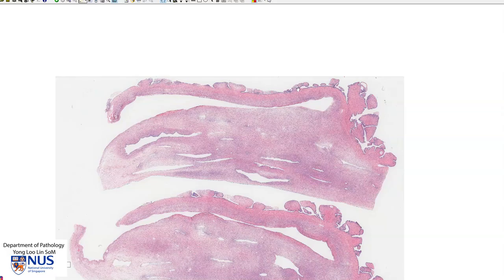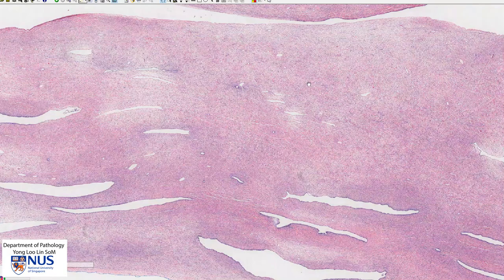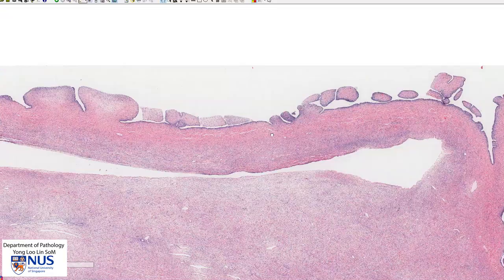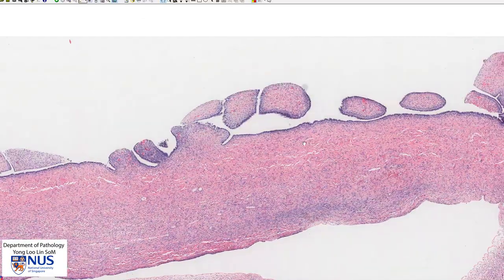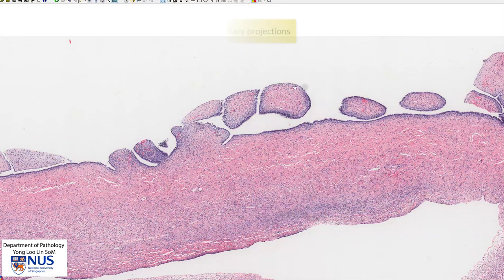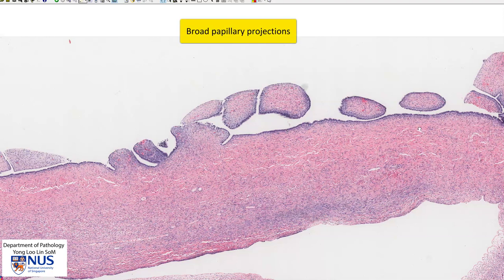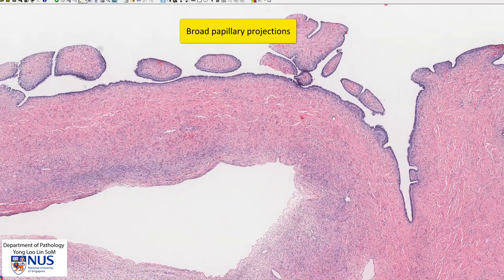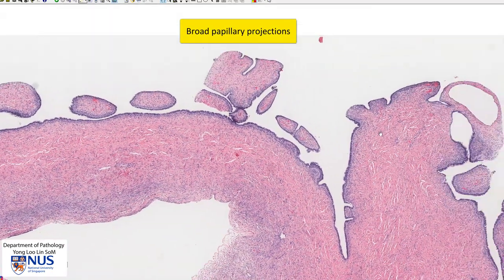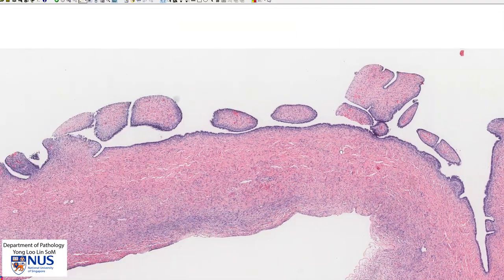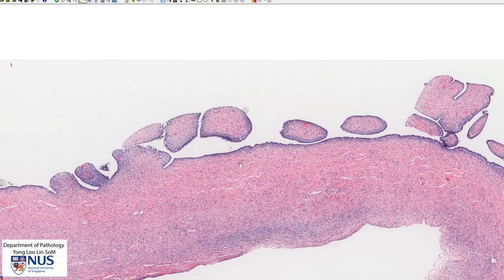Let's have a look at the lining. You can see here that in some places the lining is quite flat and in other places there are these quite broad papillary projections with fibrous cores. This is quite classical for serous cyst adenoma.